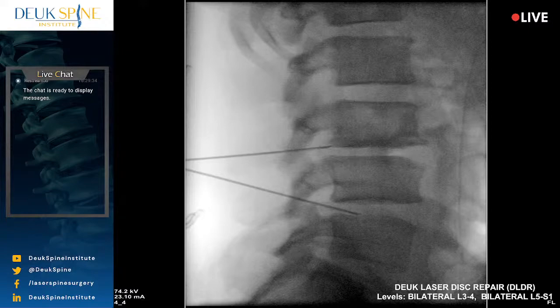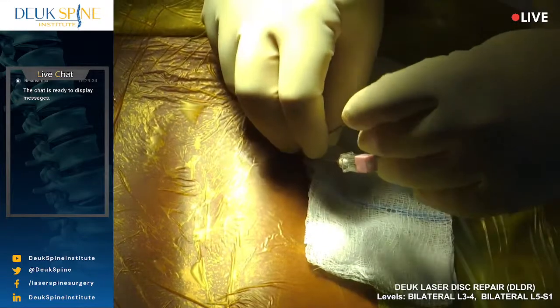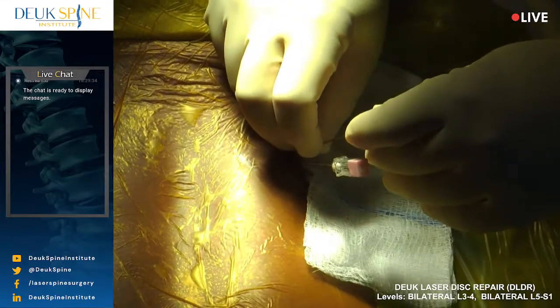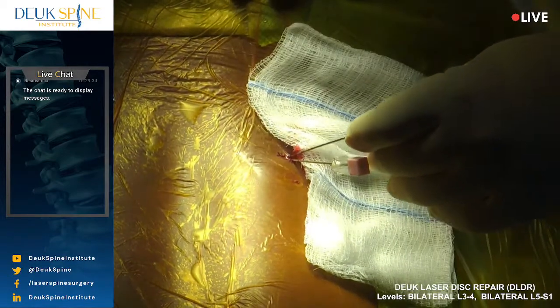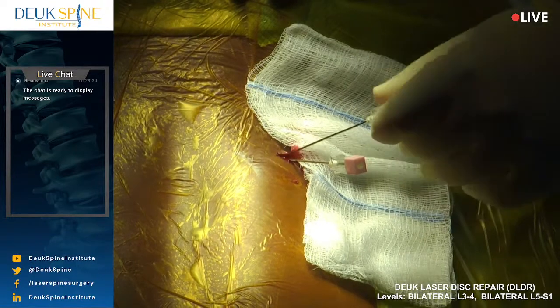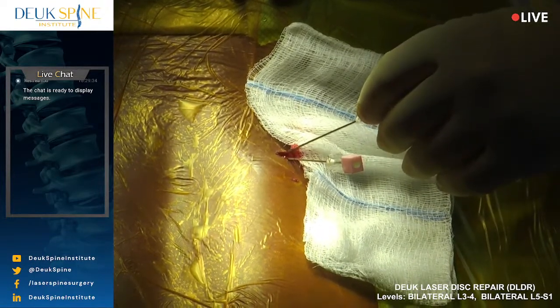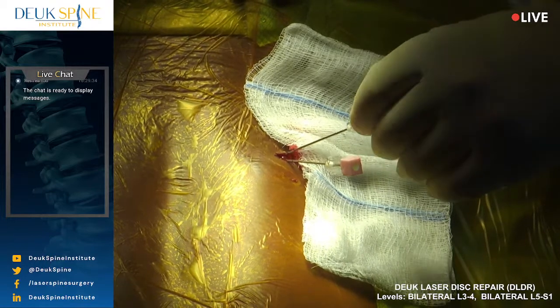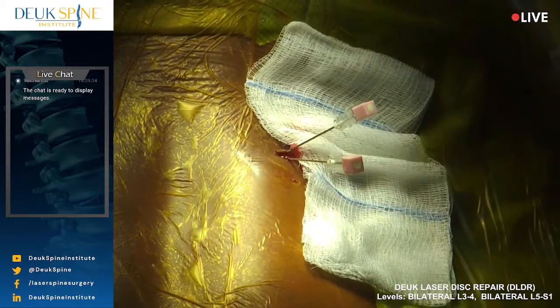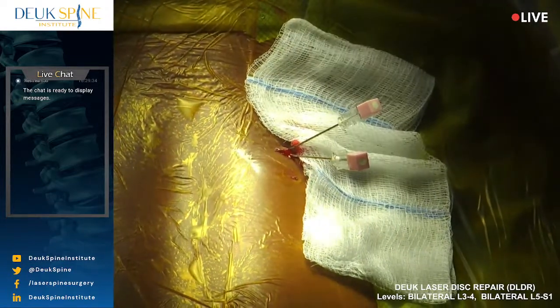Okay. But you really want the leg pain gone more than anything, right? The weakness in your legs. That's the main reason we're here. We are going to get rid of your back pain as well. Where do you feel that? All right, perfect. You're doing fantastic, by the way. Really, really good. Let's get some more numbing medicine.